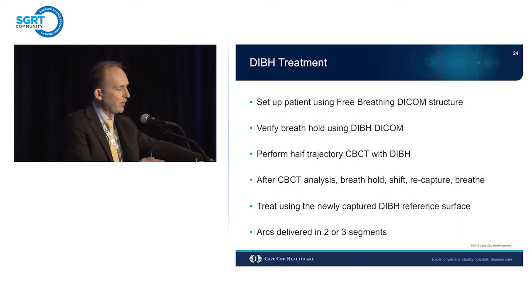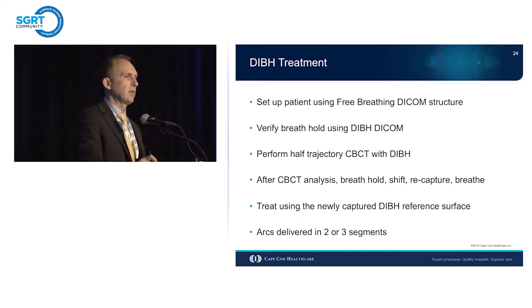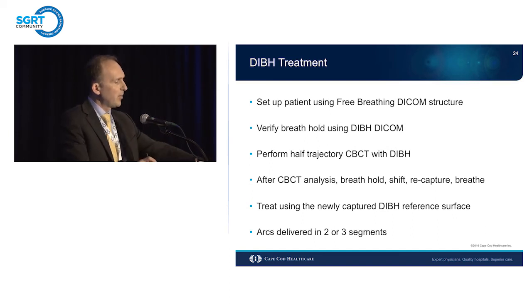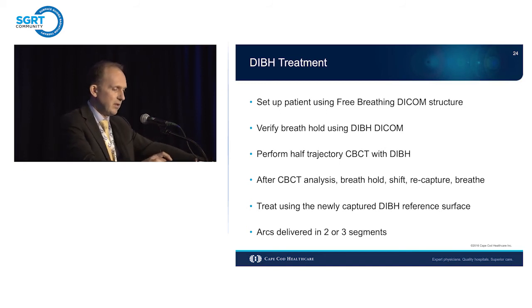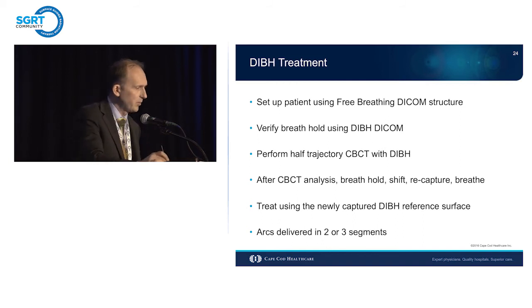Now again, back to the sim for a second. When you coach them about breath hold, that seems to be a recurring problem, that some do too much. We tell them it's a nice full breath, but you cannot go too much, because if you do, your back starts arching. That's very hard to reproduce in the treatment room. They're going to be doing this differently every day. So we're trying to tell them about an 80% full, comfortable breath that they can hold for that 20, 30, 40 seconds. That would be perfect.